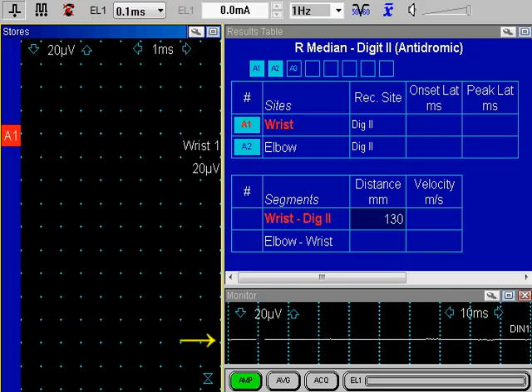The monitor trace shows the signal baseline. It should appear flat, indicating minimal noise and interference. Sometimes in the sensory nerve conduction, one may get significant power line frequency interference. This can be attenuated by using the so-called notch filter. The filter can be turned on by clicking on the icon in the toolbar. In this recording, we have a very nice flat baseline, and therefore the use of notch filter is not needed.